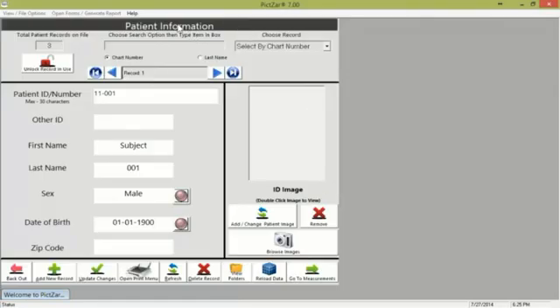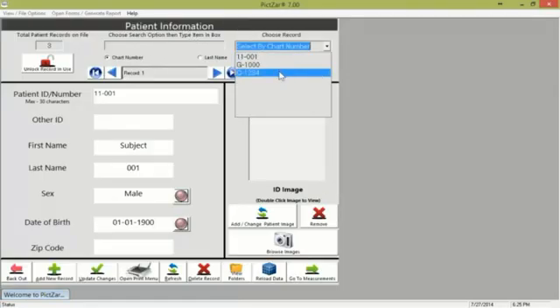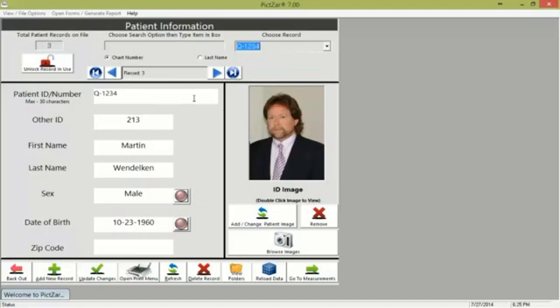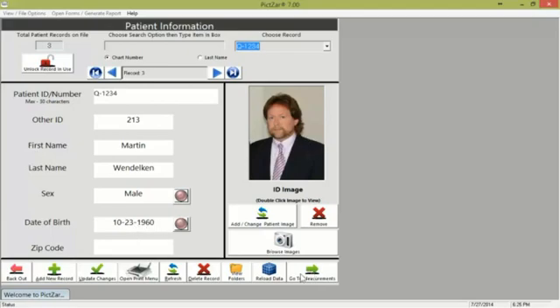We begin by choosing a patient record, which can be done from the drop-box or you can enter it manually, either by chart number or last name. There are five fields that need to be entered for a new patient: the patient ID, the first and last name, the sex, and the date of birth. An optional field called 'other ID' is used to identify the facility, such as a Bronx VA. Lastly, there's also an optional patient image field.